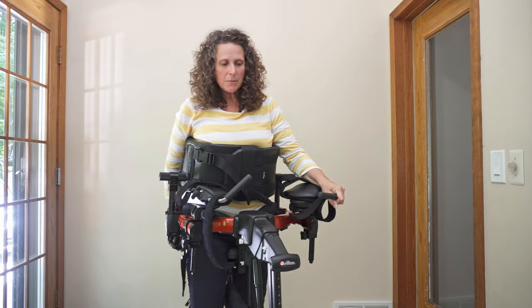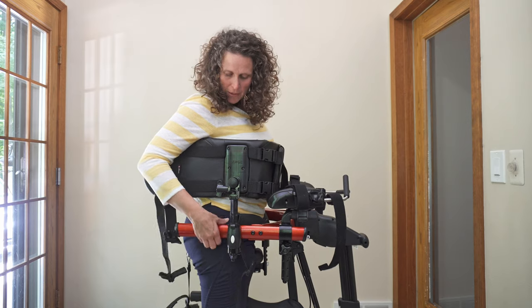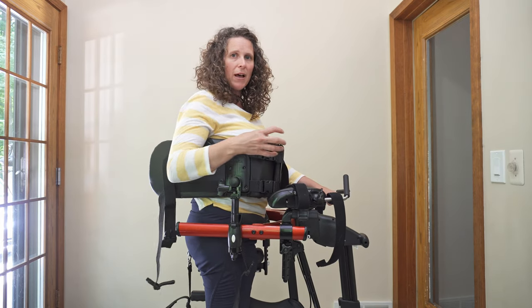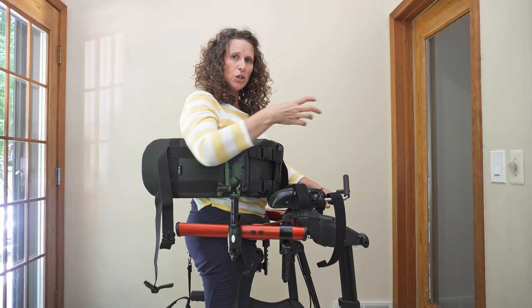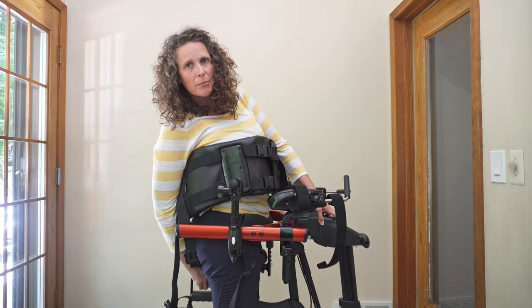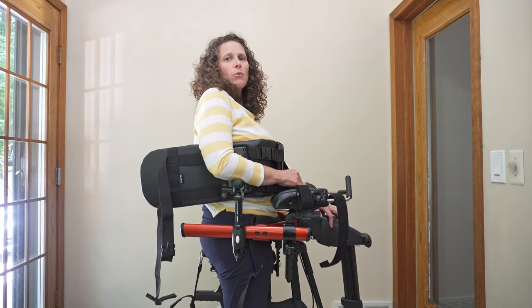I want you to be cognizant of the height of your pacer frame so that it is at their hip level. Then to adjust the pelvis, you are going to go ahead and push the hips forward, and you're going to do that by pushing the little button that is underneath the seat.